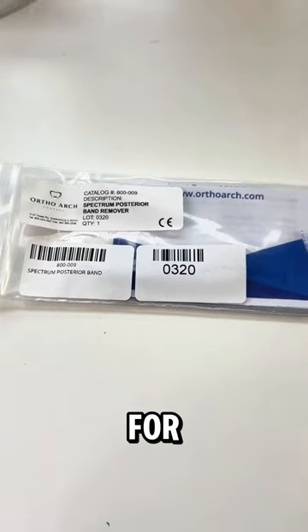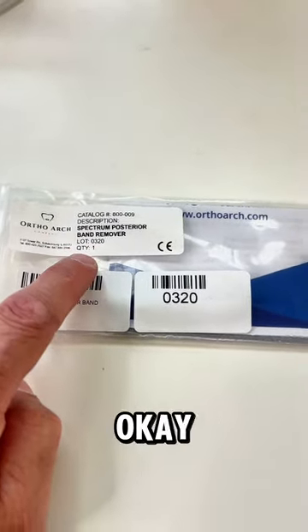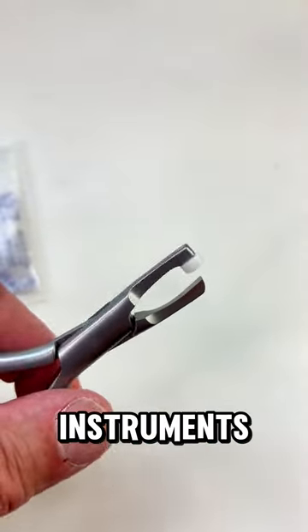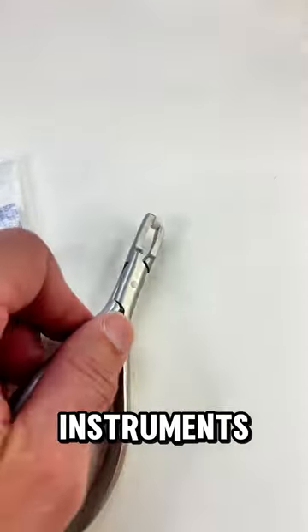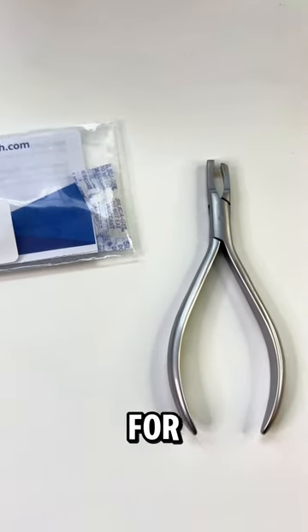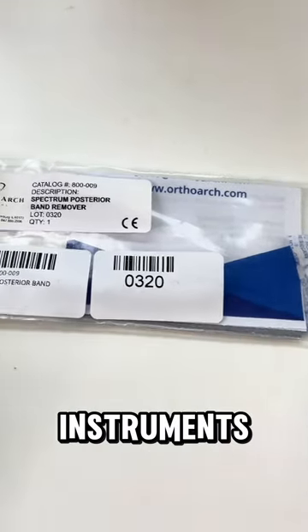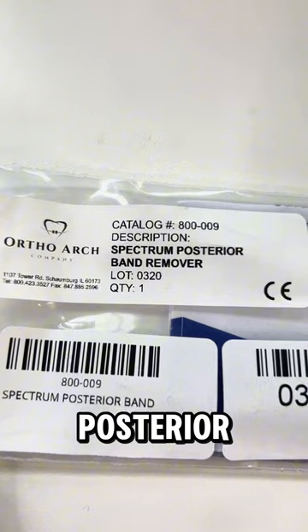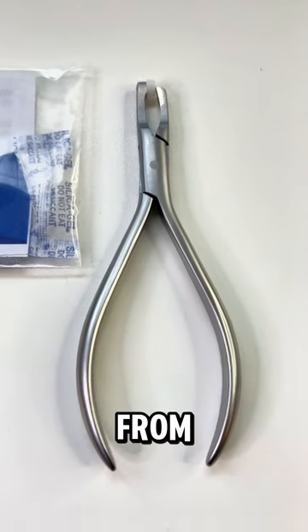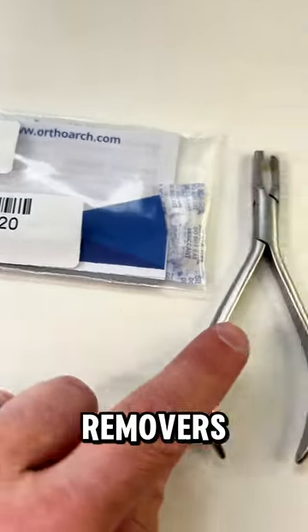You will also need a band remover. This is what the band remover looks like — you're going to need one of these instruments. Remember, you're going to be using these instruments for treating patients as well, not just for the typodont exercises. This is a posterior band remover used to remove bands from the molars, both on the typodont and for your patients.